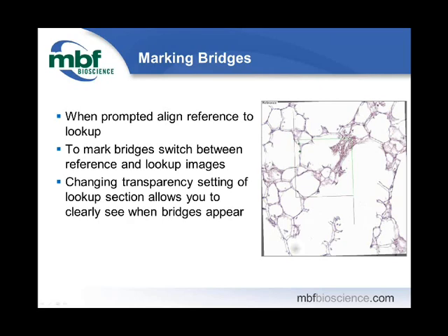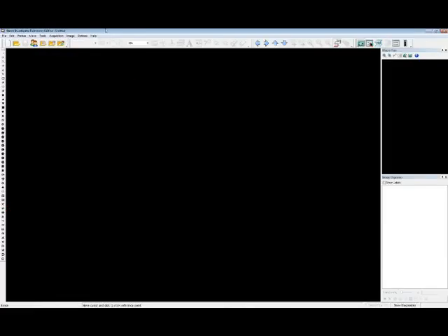And of course, when we do stereology, we're seeing random events, and we may or may not see any bridges. Hopefully, we'll get some when we actually go through with it. But I want you to have the opportunity to see where there were no bridges and where we actually got bridges connecting. And at this point, we'll proceed to the software.